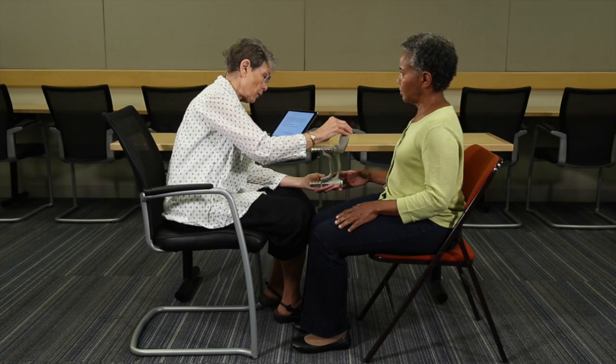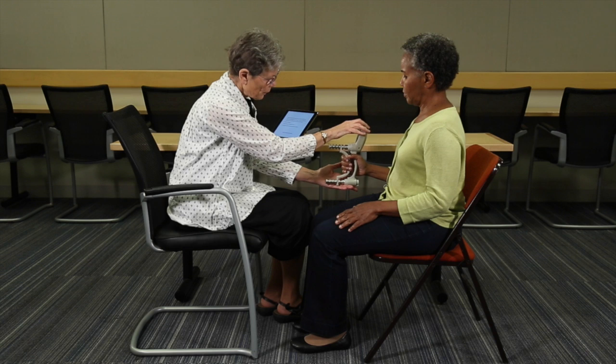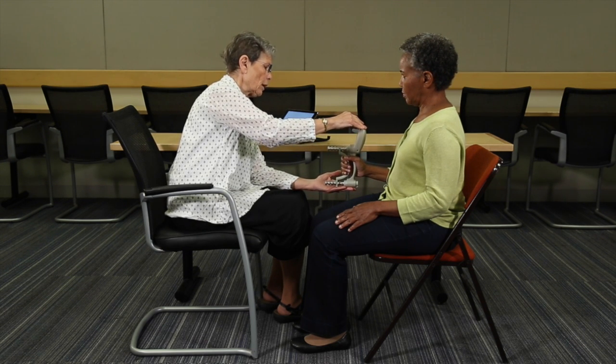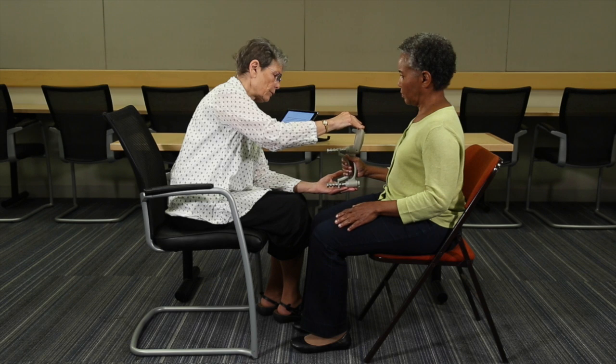We're going to practice. So again, when I say squeeze, I want you to squeeze hard, but not as hard as you possibly can. Okay? Okay. So you move your arm in a little bit. Okay, great. 3, 2, 1, squeeze.